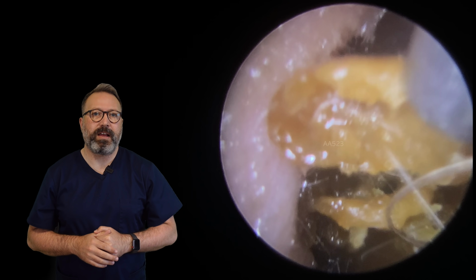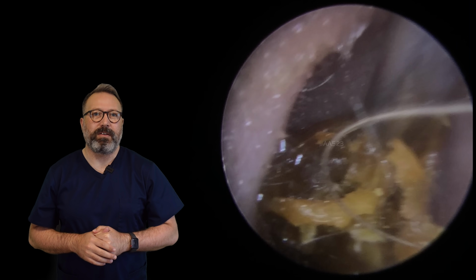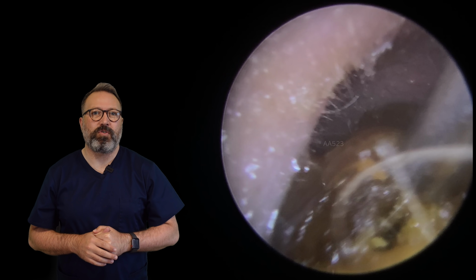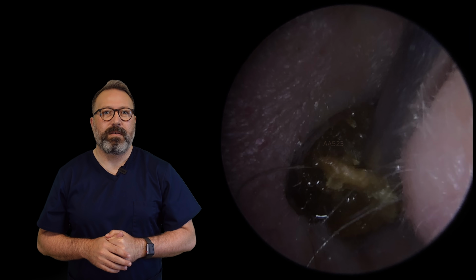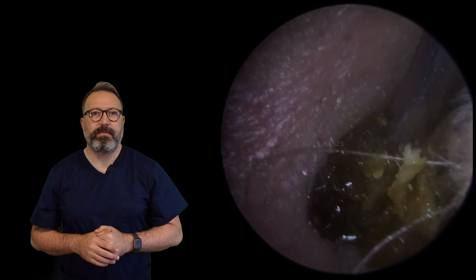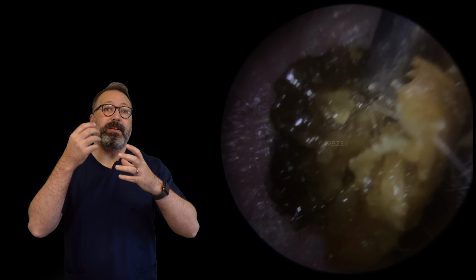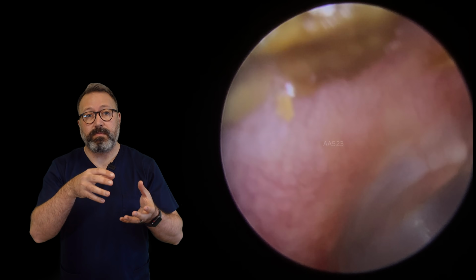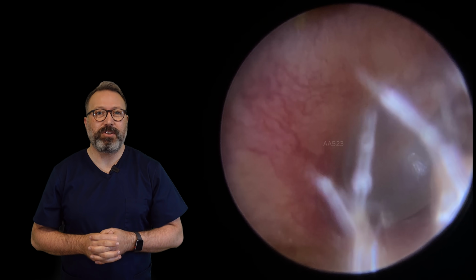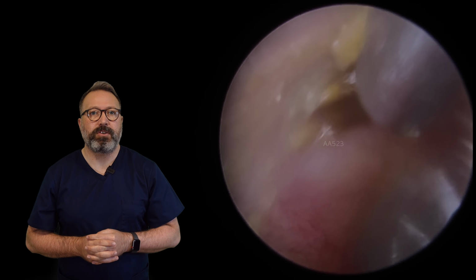Plug's working its way down the canal. Oh, here we go. Just got that top section away there. Let's go in now and grab the next section. It's all moving really well now on this ear canal. There it comes. Is it going to come out? Yes, it is. Sometimes with these plugs, you might have a little tail of skin that's still attached to the canal wall. So as you draw this out, sometimes the little tail of skin will hold it in. There's a little bit just at the top of the canal, but the ear canal itself is looking lovely and clear. Let's just grab that section.